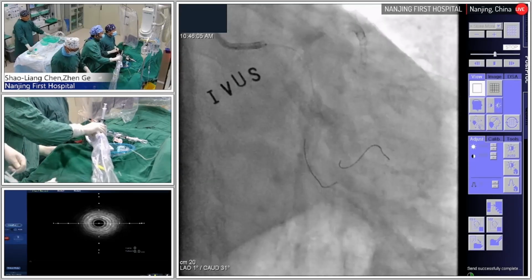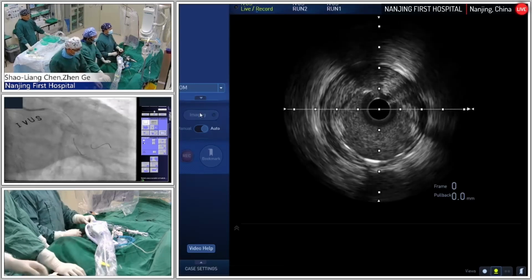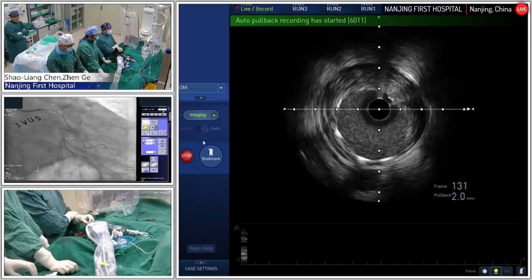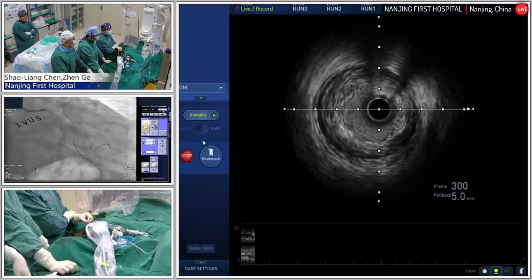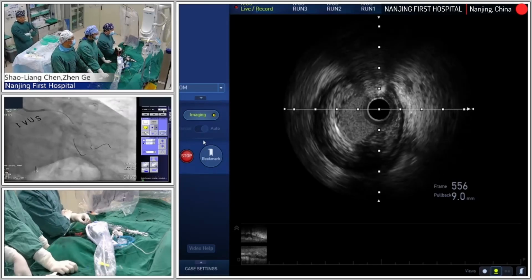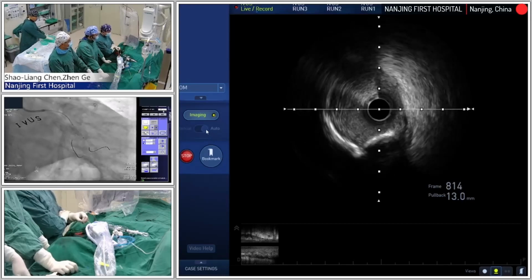This is also a very challenging case. One month after acute myocardial infarction and primary PCI. Calcified proximal circumflex. The bifurcation stent is expanded very well, but it looks like a large vessel size. The vessel diameter looks like 1, 2, 3, 4, 4.5, more than 4. So I think after the stent, you need to use a 4.0 NC to post dilate.